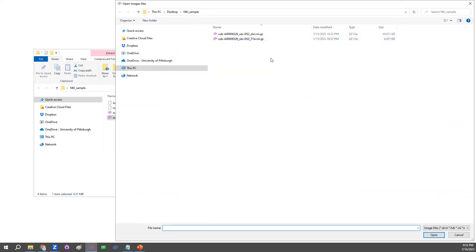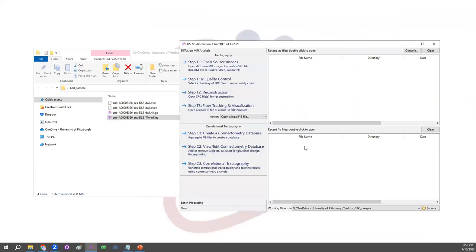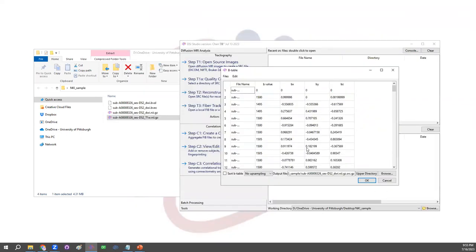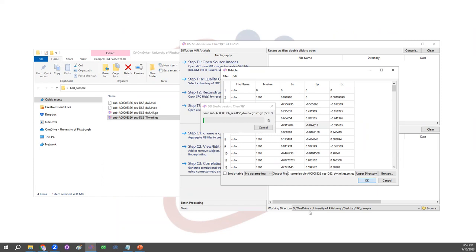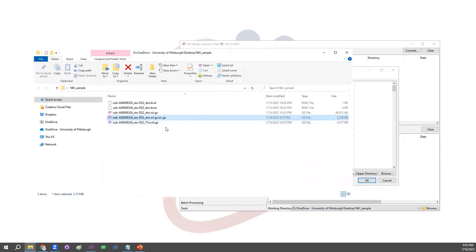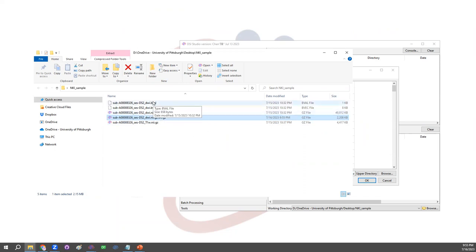So let's start with the first button. Click on the first button and select DWI data. DSI Studio will open the Nifty file, bring in the b-value and b-vec, matching them. And here, just click OK. And DSI Studio is going to generate one file with this extension that is .src.gz. This file would aggregate the value, the vector, and also the DWI signal into just one file. This will be available for the next step for reconstruction.